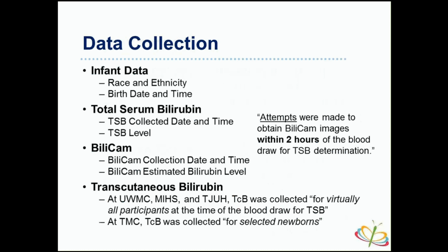Some institutions also provided data correlating this with transcutaneous bilirubin, and 3 institutions noted that they collected it for, quote, virtually all participants at the time of the blood draw for the serum bili, and at one institution it was collected for selected newborns. That's the only information that we're given.